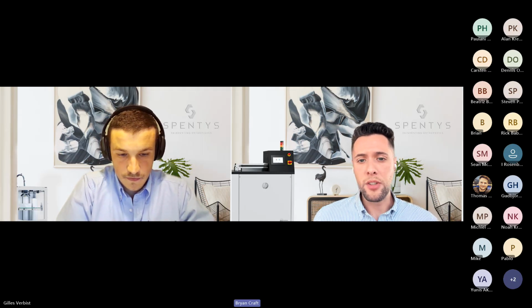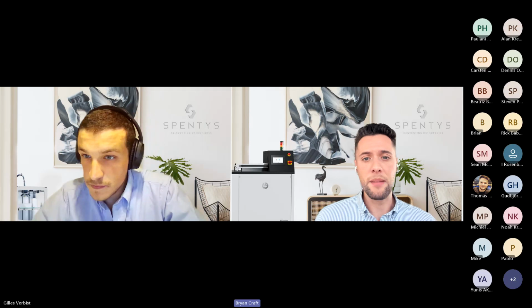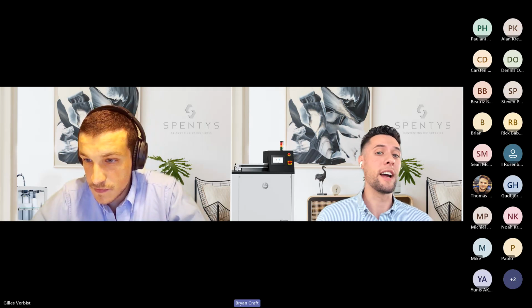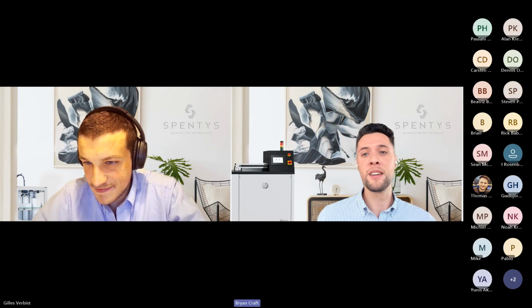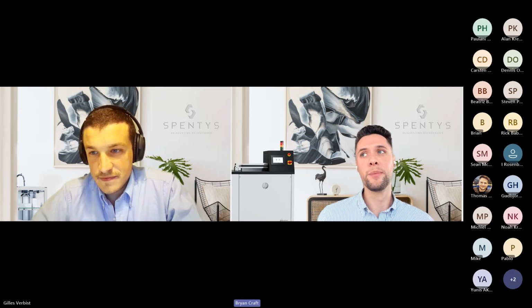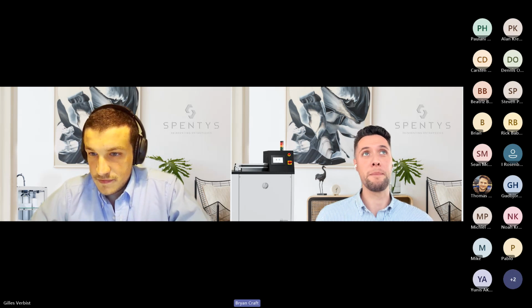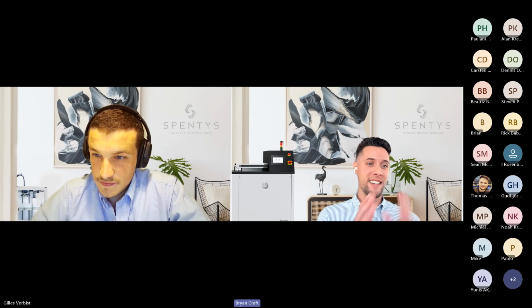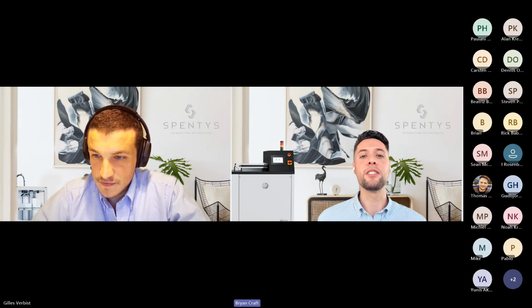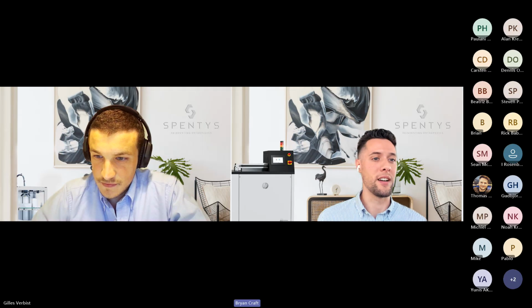Let's keep on rolling. So Dennis has been scanning directly on children for years. I would love to figure out how you did that, Dennis, and how you do it on a regular basis, because a lot of times our partners, especially new clinicians getting started with digital workflow, find it's like a game with the kid. You've got to keep them distracted, maybe with some candy or a screen, and you just say, okay, hold still. And I think your scanner really matters a lot if you're scanning directly on kids too.